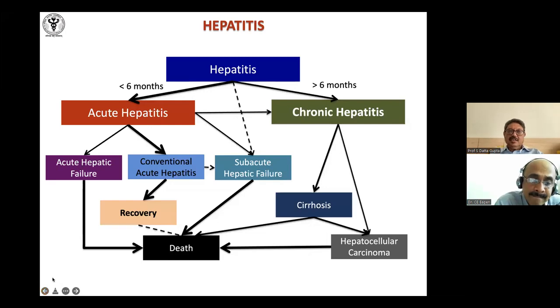In a liver biopsy, which we do generally for hepatitis and other things, the mainstay is H&E, hematoxylin and eosin. Then, instead of special stains, we call them usuals. One is diastase PAS, the other is reticulin, and a stain for collagen, Sirius red or Masson's trichrome. So these four stains are generally done routinely in all liver biopsies.